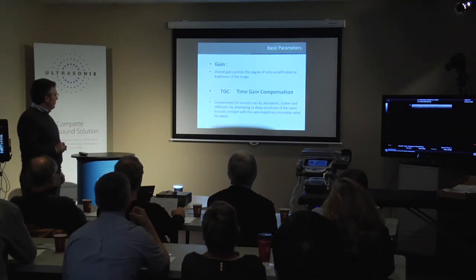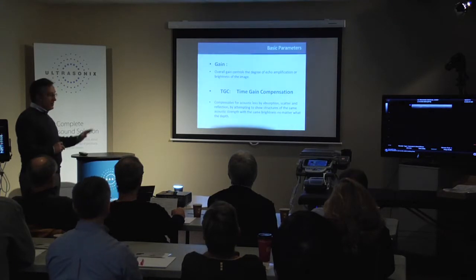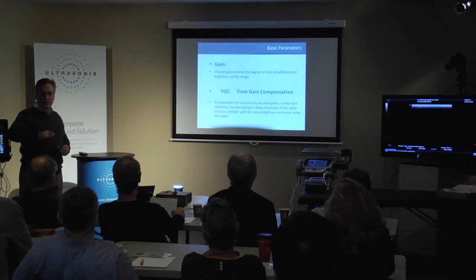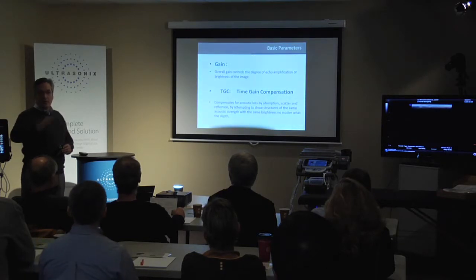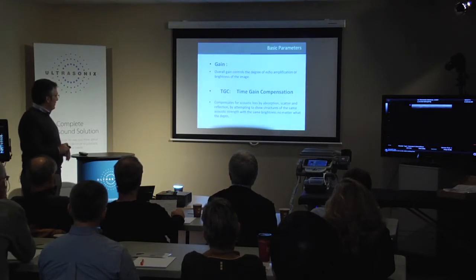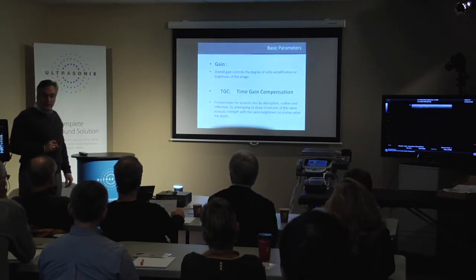Gain, as I share with you, overall gain, the echoes are amplified in the overall image. So you may want to turn up, and try to do this always incrementally. If you turn the knob, you're going to get overgain and too much artifact, which will detract from the tissue differentiation and border appreciation to identify structures of choice. Are there any questions so far?